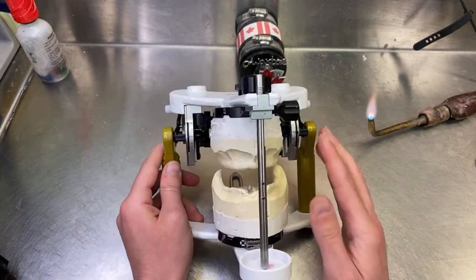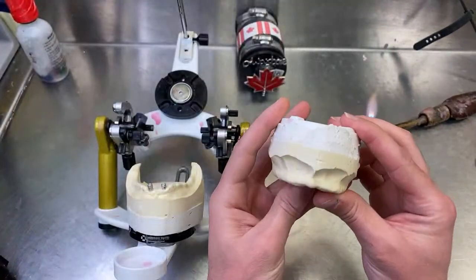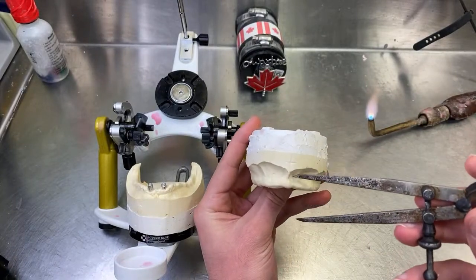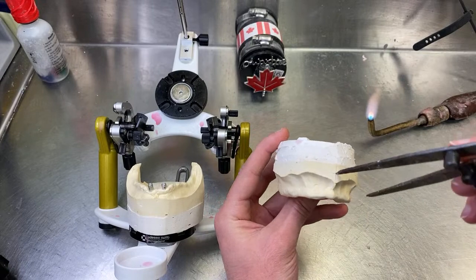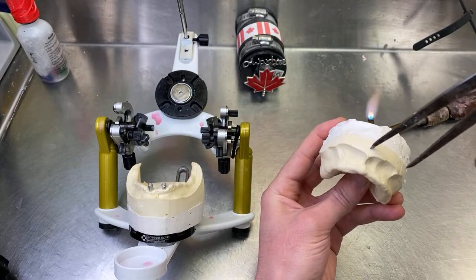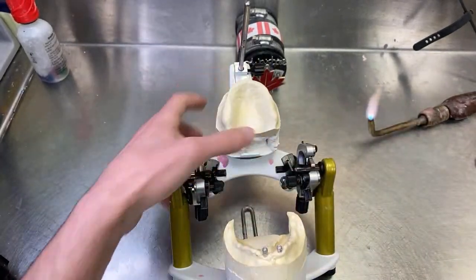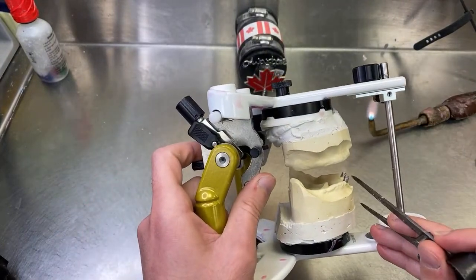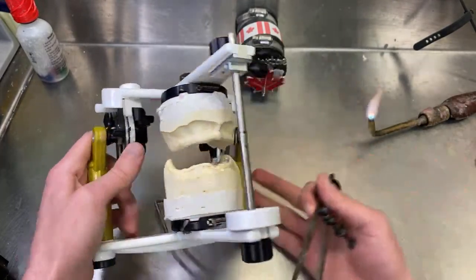Okay, so we took an impression of the patient here, and we took the measurements of the old denture. It was on this. Then we marked the center line right here and the horizontal line here. We measure from the old denture and then mark it on here. So now we have all the marks we need. I know how much support is needed looking at the patient, and also looking at where the lower denture is and how those implants are.